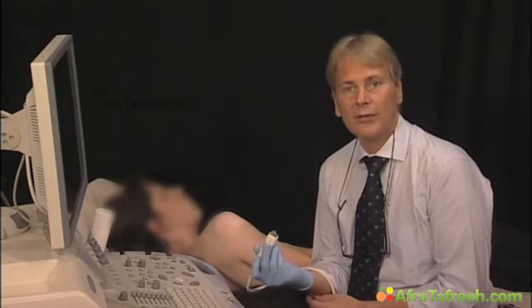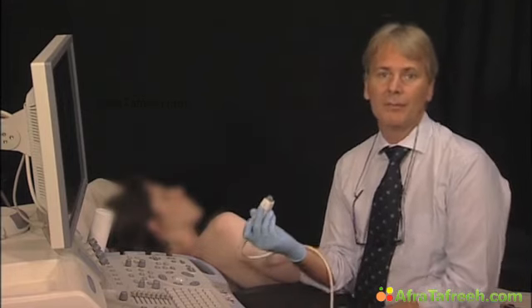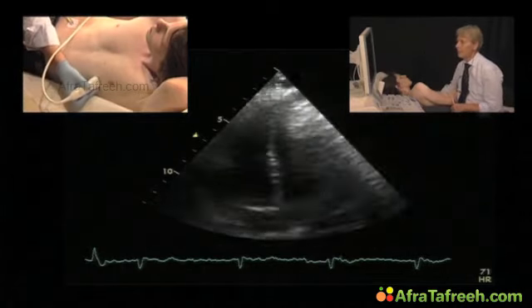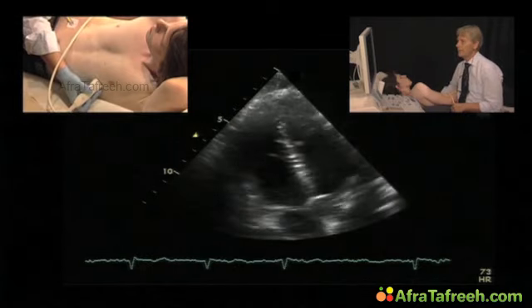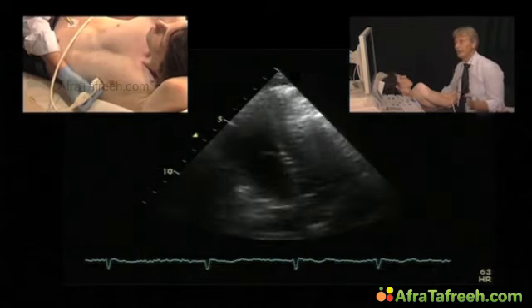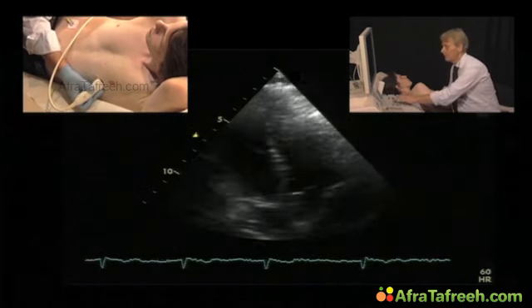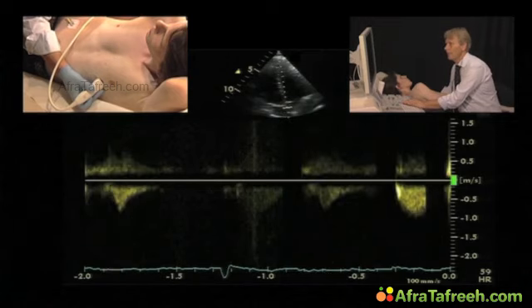The continuous wave Doppler across the aortic valve is very similar to the pulsed wave Doppler. Basically, you would perform it when you're expecting higher velocities. But there's just a few points that I would like to make. First of all, we have the same transducer position as we had before, 5-chamber view, but a bit more lateral so that you have a better orientation with respect to parallel alignment with the ultrasound beam. Then you would place the continuous wave Doppler beam across the aortic valve.